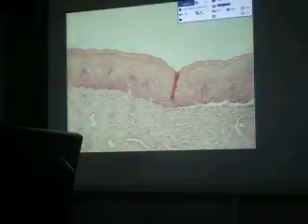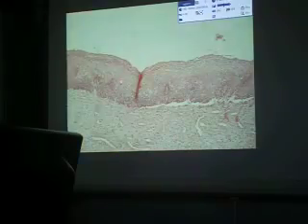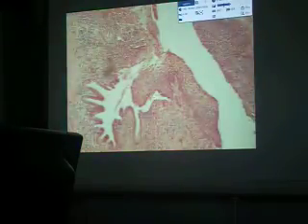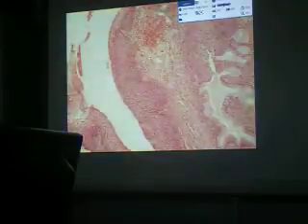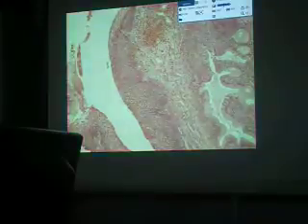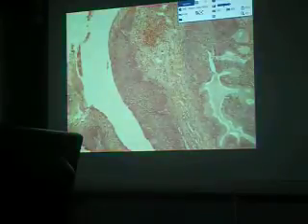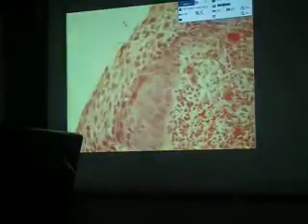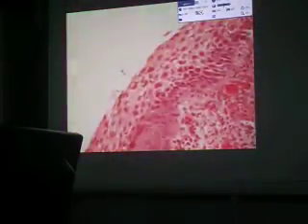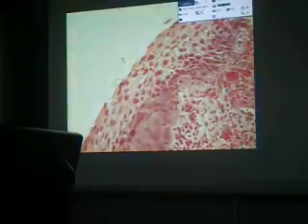So most likely, the cause for the abnormality of this slide, that is just a minor abnormality. The major abnormality that is present in this slide is shown in that portion. Now, how will you describe the size of the nuclei? Is there a gradual decrease in size of the nuclei? Okay, no. The size of the nuclei at the superficial layer is almost as large as those in the basal layer.